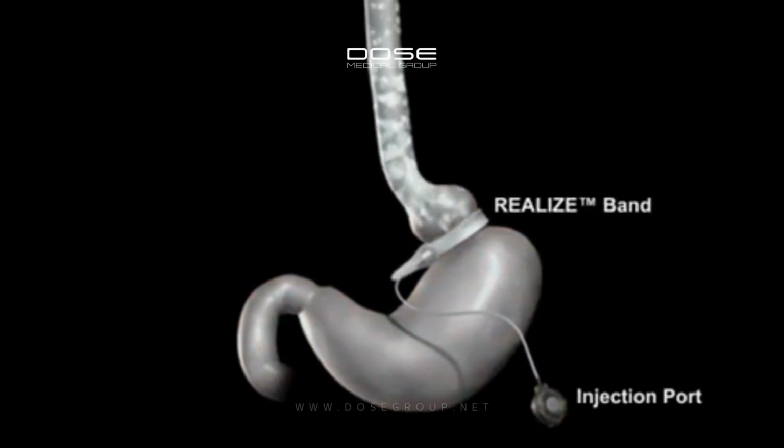The Realize band does not alter your digestive function. Food consumed passes through the digestive tract in the normal route.